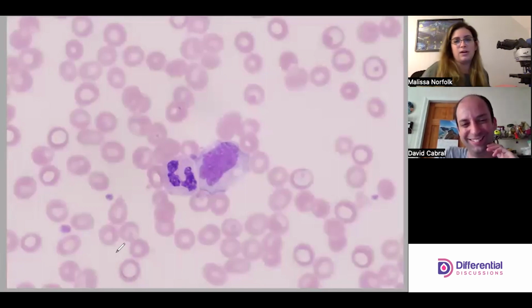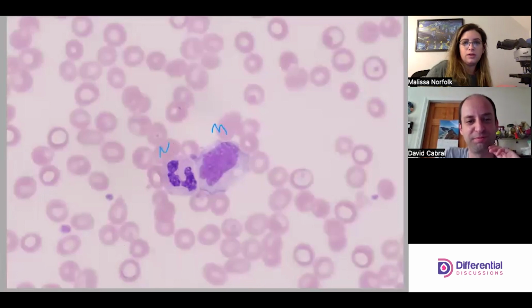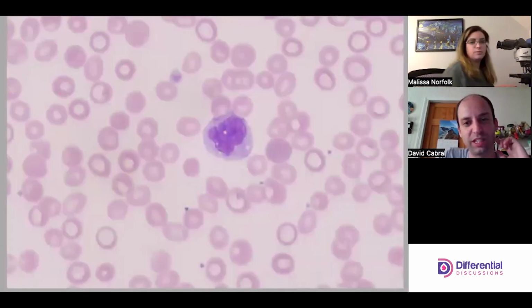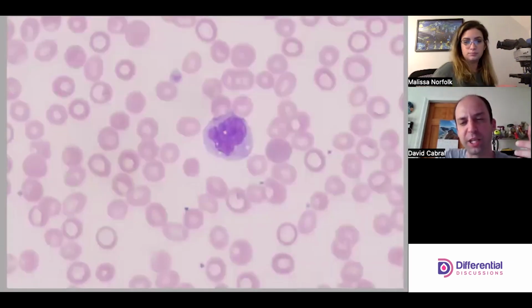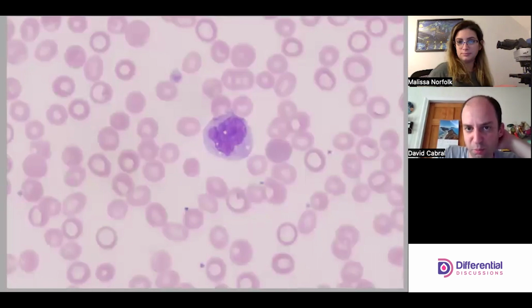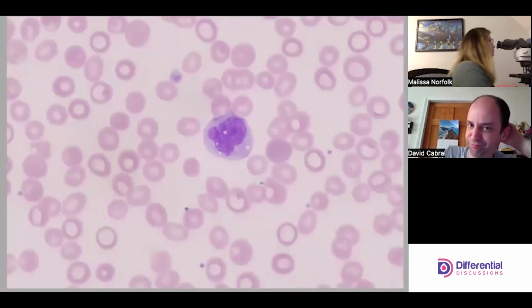I know. And so just for reference, this is the mono we were just discussing, and this is just a neutrophil. And that one actually isn't bad. You can actually see the granules. That one looks much closer to our norm. Some of those other neutrophils don't have even a texture to them really. Yeah, more mono.